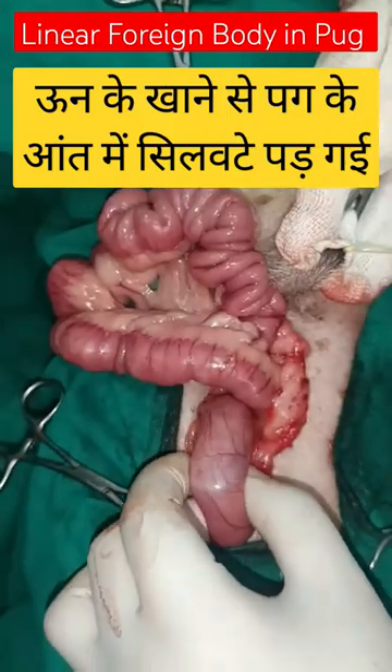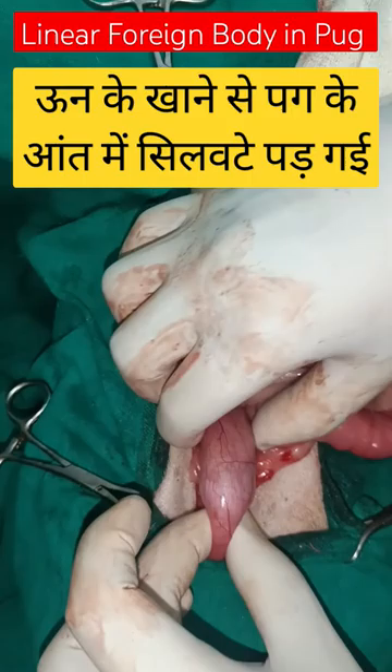This is a case of linear foreign body in a nine-year-old pug dog. I have just performed the laparotomy and exteriorized the stomach.